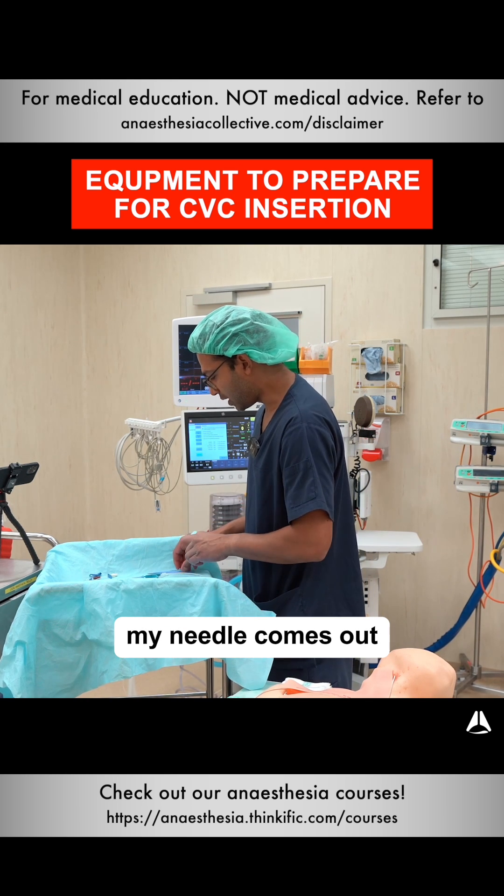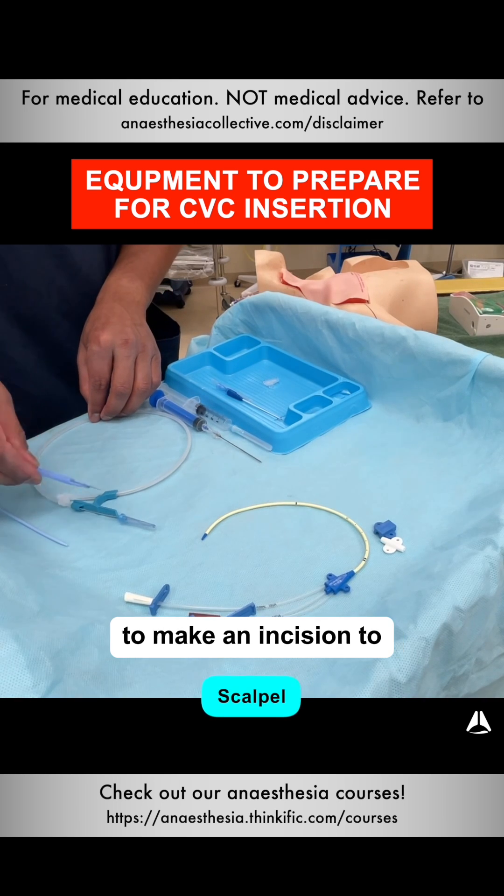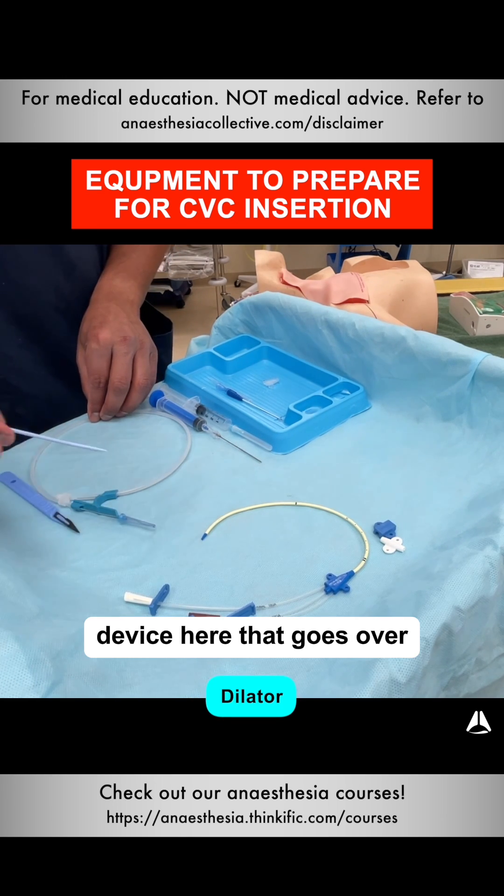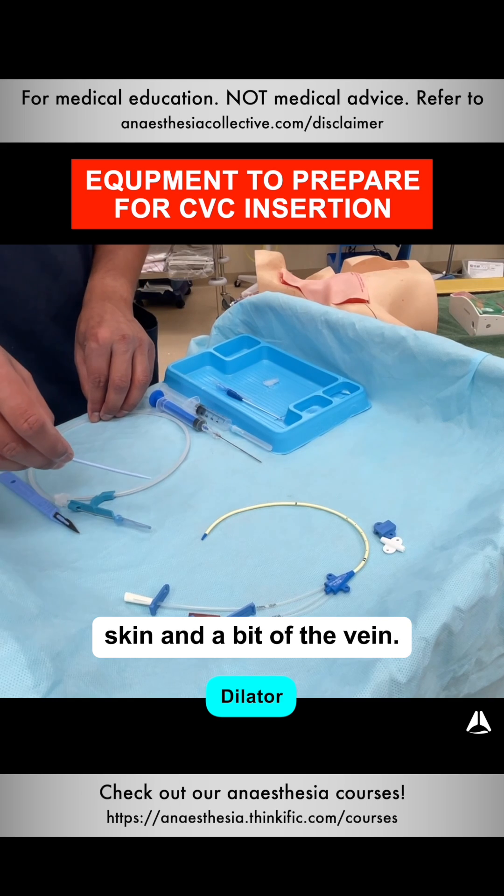After the wire goes in, my needle comes out and then I use a scalpel to make an incision to widen the skin incision. I then dilate with this device here that goes over the wire and dilates the skin and a bit of the vein.